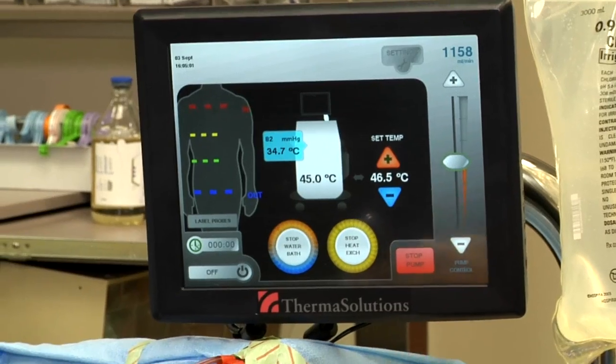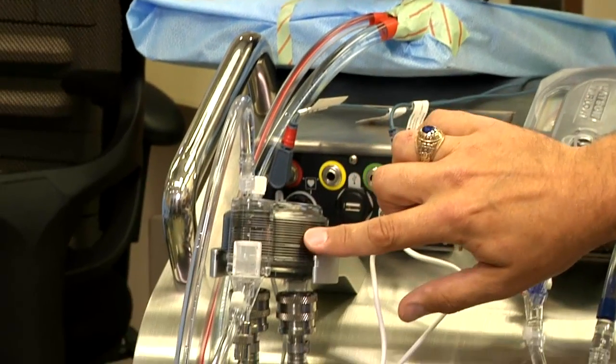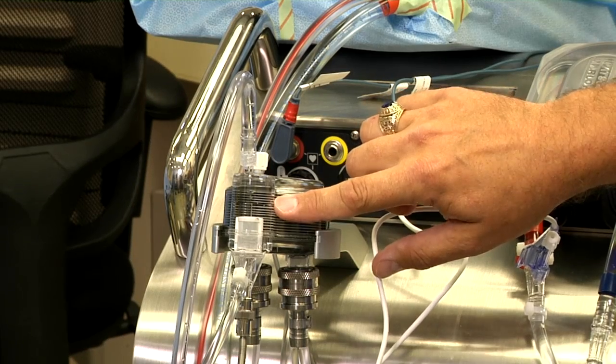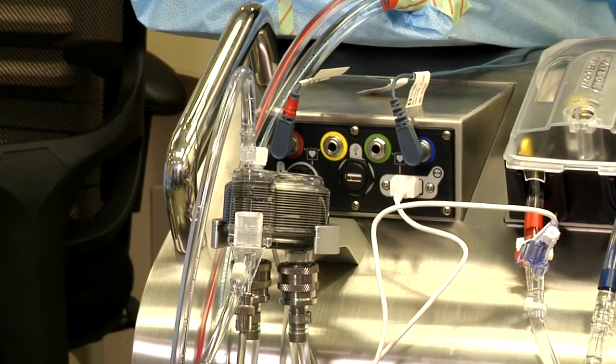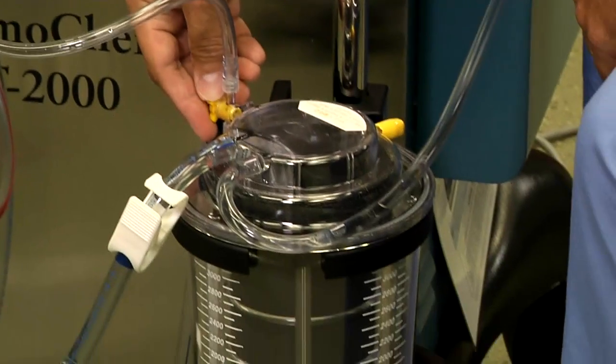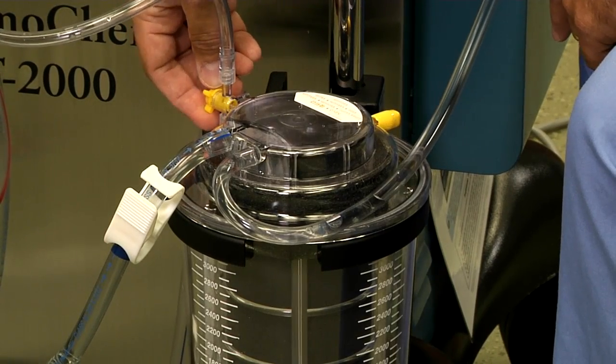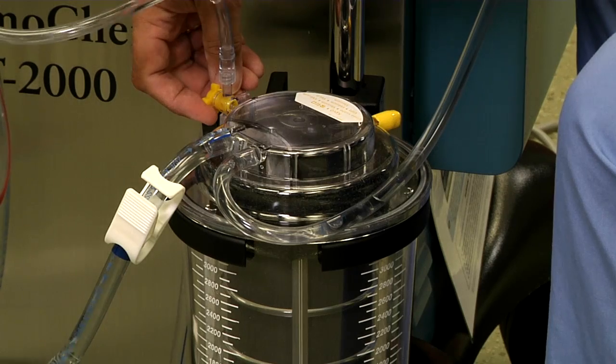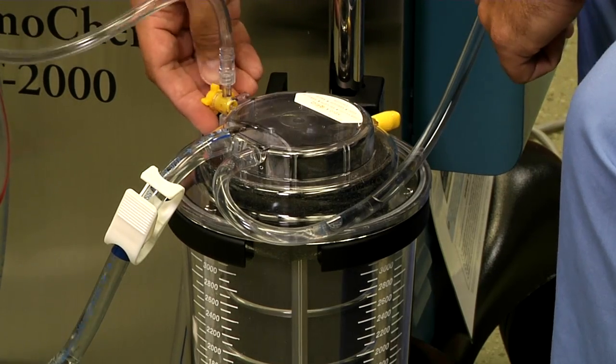Something else we do is clear any air from the heat exchanger. This is accomplished by going to the reservoir and very slowly and briefly opening up the recirculation line to remove any air.